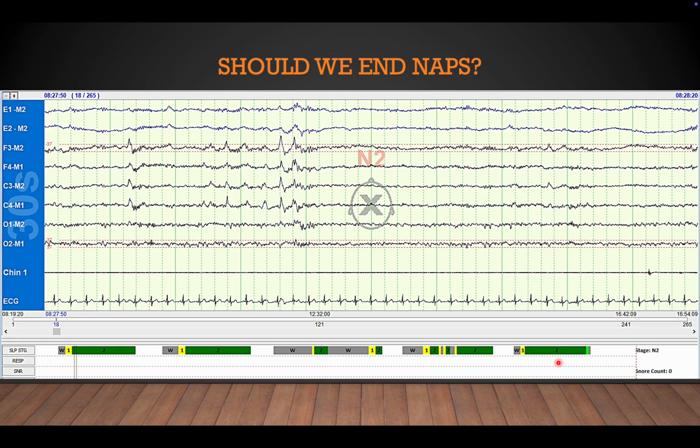The mean sleep latency may be affected by several factors, and having the fifth nap may give a shorter mean sleep latency for the correct diagnosis, or sometimes it may give a longer sleep latency, excluding pathological sleepiness. Hence, completing the fifth nap is essential. Don't get focused only on SOREMs.